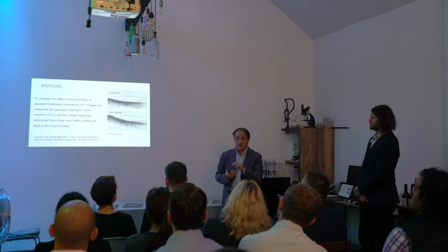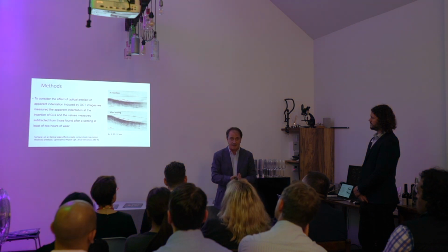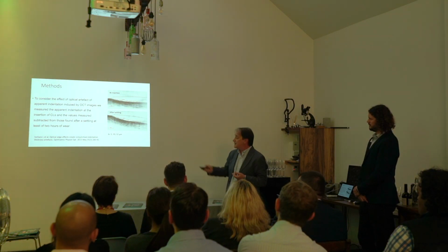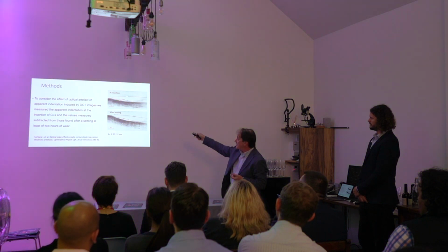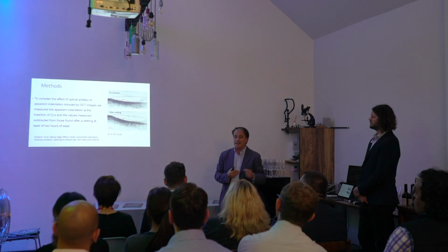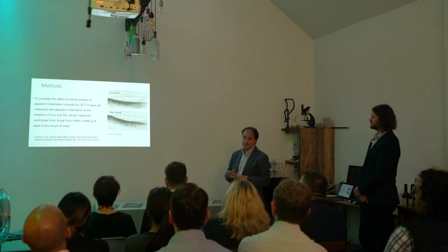And we consider also a problem, because sometimes it seems simple to evaluate the result with the OCT, but it's not simple, because the index of refraction changes or introduces optical artifacts. And I can consider in this case, okay, I have a compression here, but this is an artifact, it's not real. It's induced by the thickness and the index of refraction of the material. So in which way can I evaluate this condition and consider the results for the final situation?